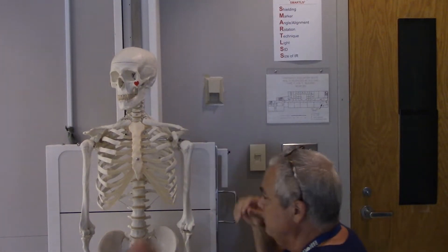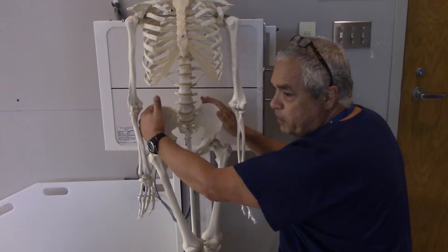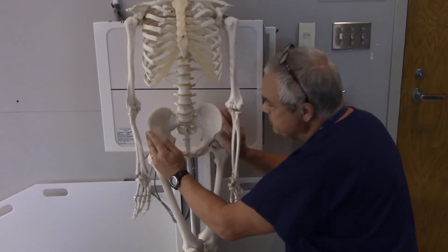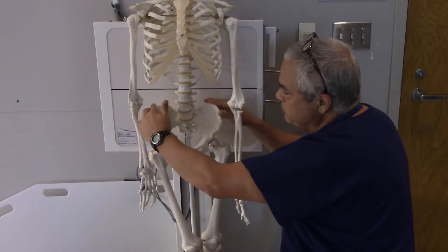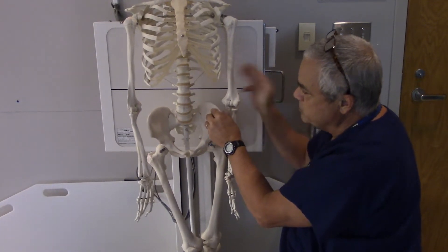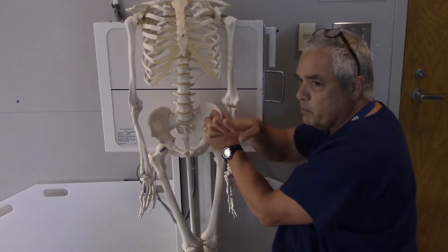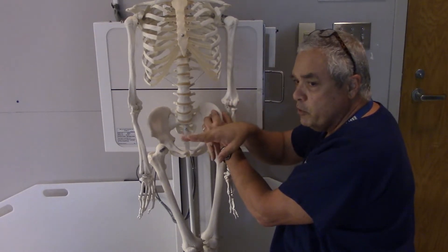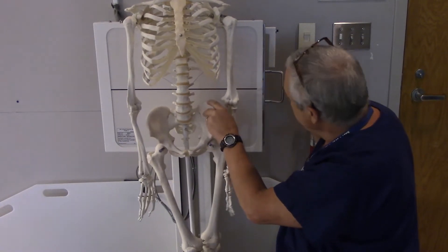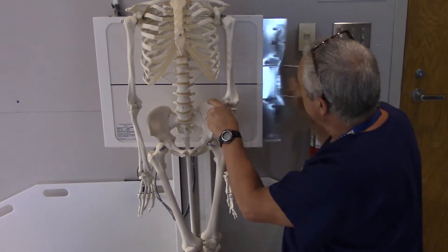It helps to take a knee, get down, and feel for the patient's iliac crests. On some patients who are larger it might be hard to find, but you can find the ASIS and follow it around until you find the top of the crest. We're going to go about two inches above the top of that crest — on me, three fingers will do it, which is almost exactly two inches.